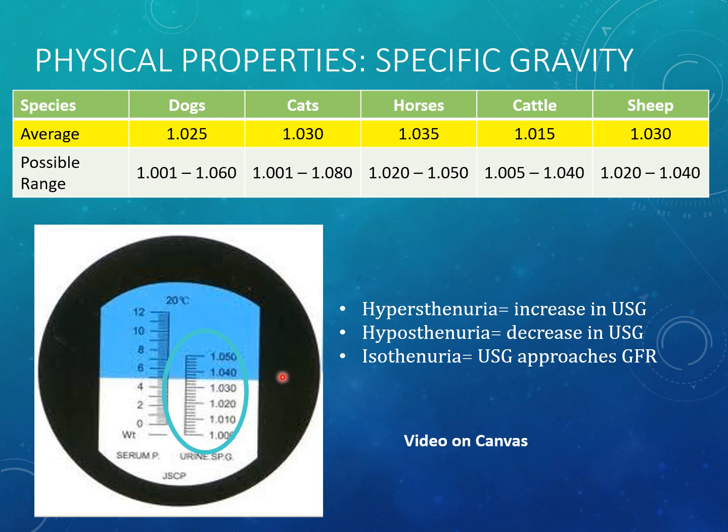So for this patient, the urine specific gravity in this case looks like it's 1.035. And again, as we discussed on the slide before, an increased specific gravity. So how much stuff is in that urine? How concentrated is it compared to the water? An increased specific gravity with a lot of stuff can be related to decreased water intake, dehydration, fluid loss through sweating or panting or diarrhea, acute renal failure, or shock.